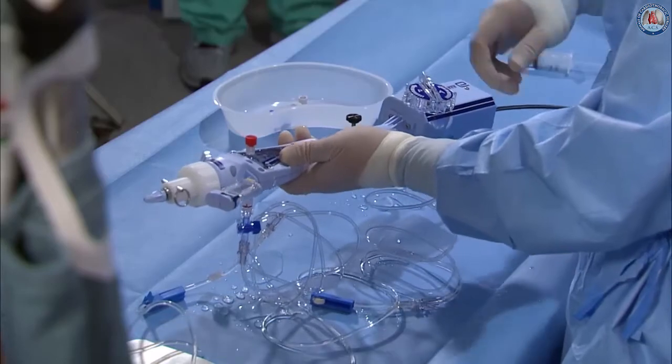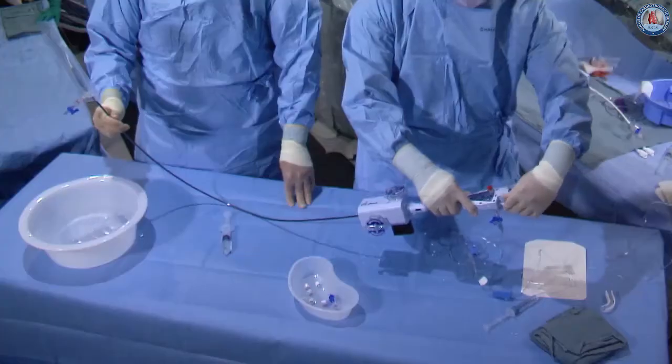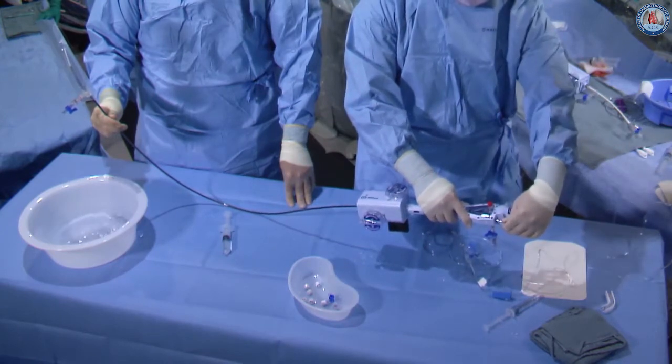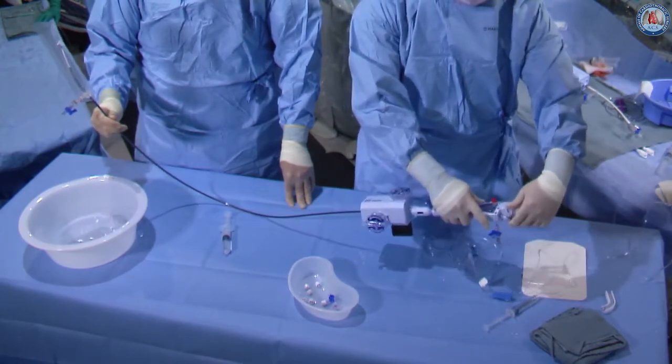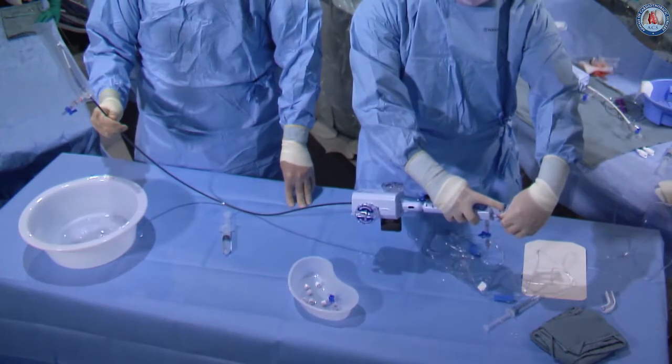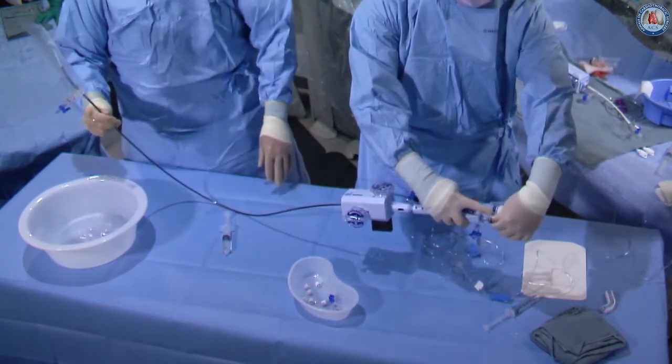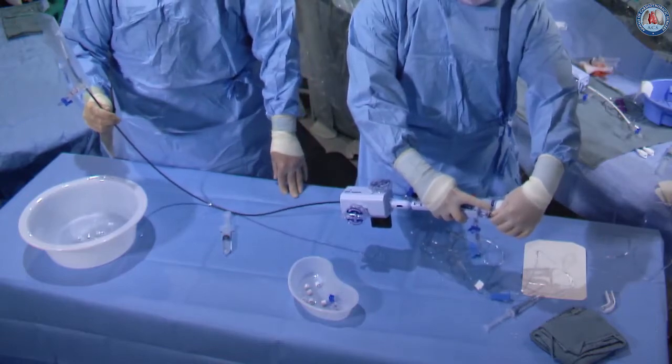Now we're going to pull back, move our lock line out, pull back and push forward, and then carefully de-air the cap itself by slowly releasing and then tightening back. We've finished de-airing the device and we're going to go through the functionality testing of the clip.